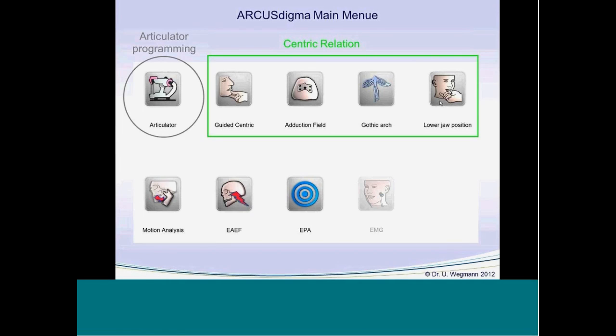This upper row here is for therapeutical use. Additionally, you can find this lower row here for function analysis, for diagnosis. And for this we have motion analysis and the position analysis.